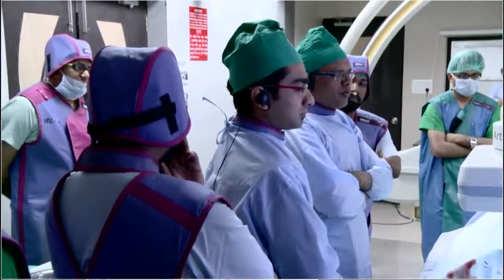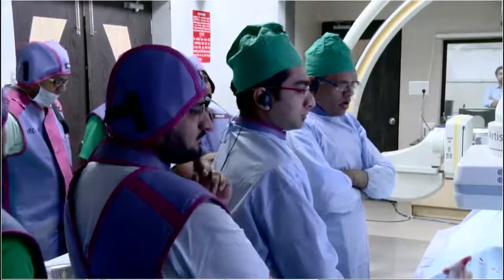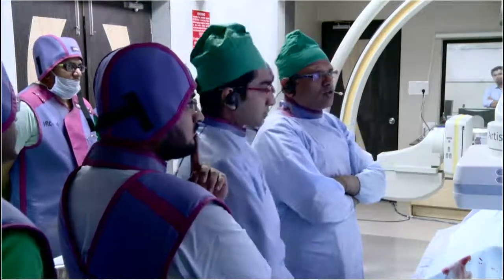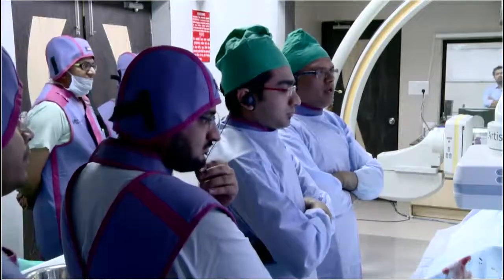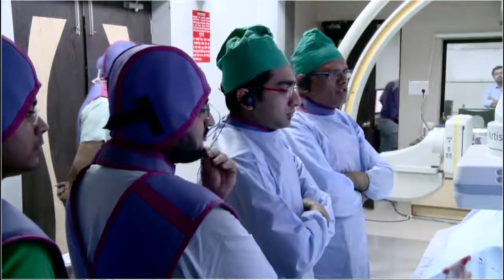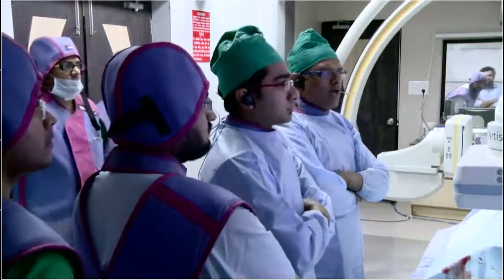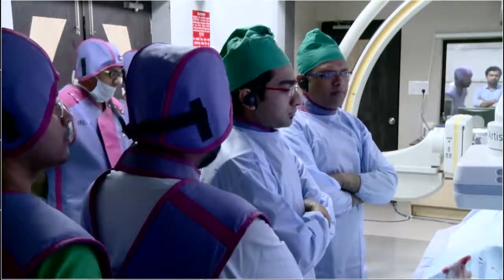For the right foot, amputation of four toes has been done. Looking at the diagnostic angiogram, we are lucky that his other vessels are good, but he has a short segment stenosis in the right posterior tibial and a narrowing distal to it. The plan is to do angioplasty for the distal posterior tibial, and for the small segment narrowing we will be putting a biodegradable scaffold.